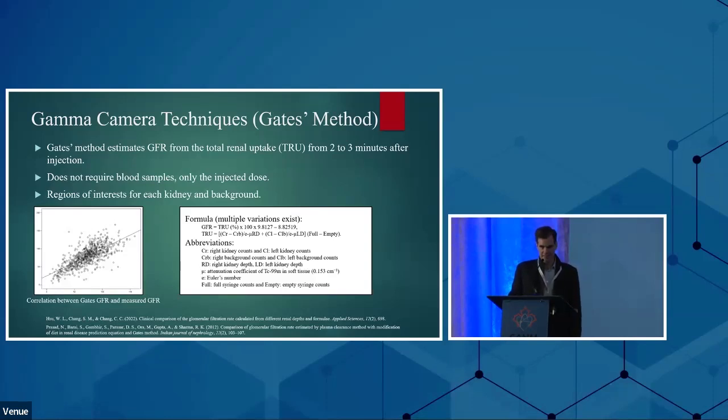This method may inspire us in the future when we use quantitation using tomography to determine the renal function.